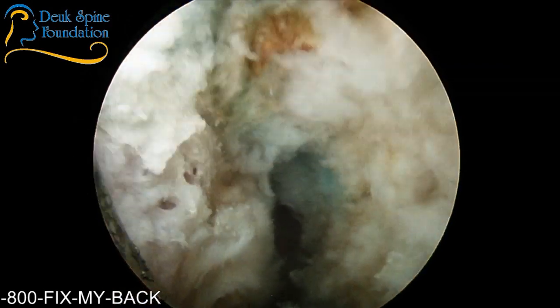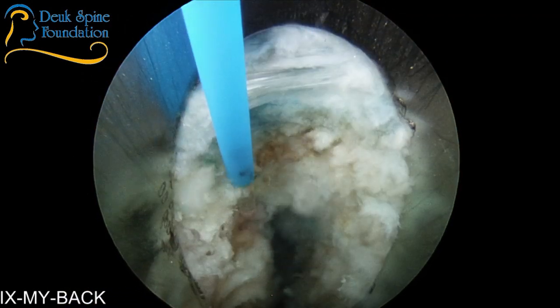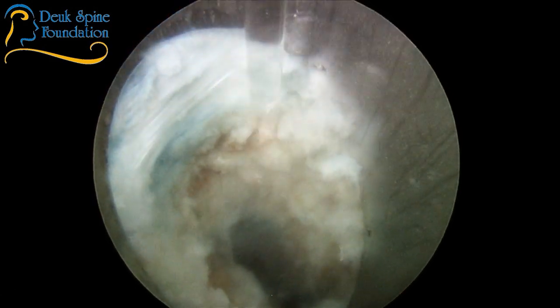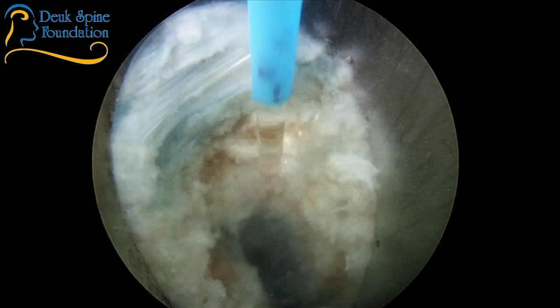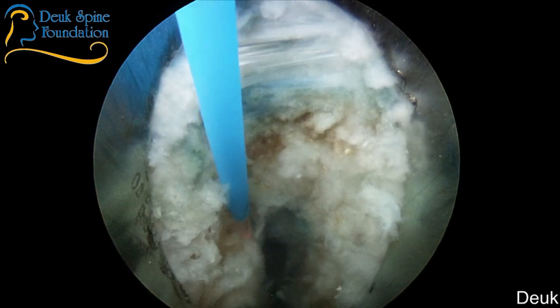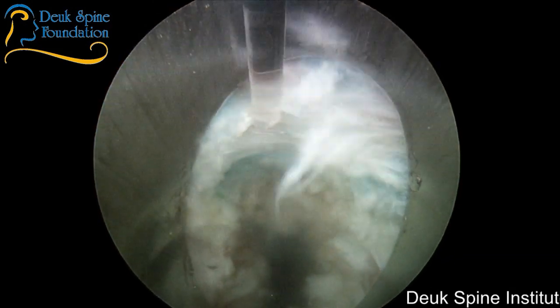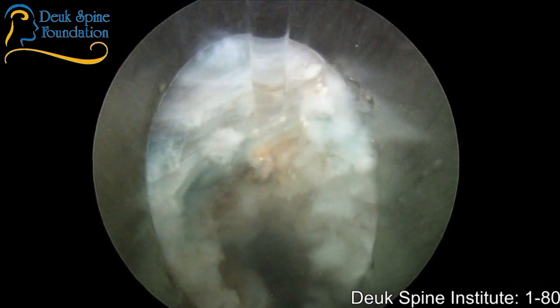But he's the guy who thought, well, gosh, if we're putting a needle in the transforaminal space to access the disc and do a discogram or a myelogram, then why can't we put a guide wire and bring in some surgical instruments, right? And that's exactly what he did.